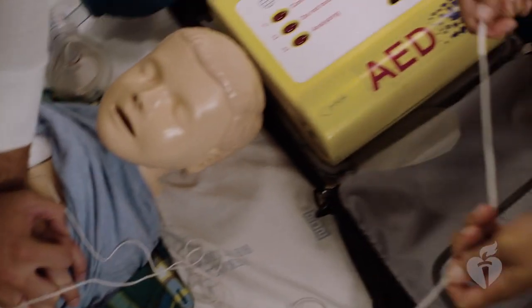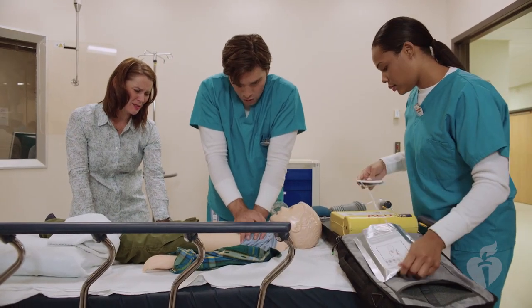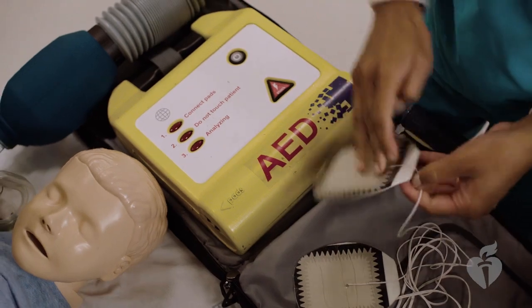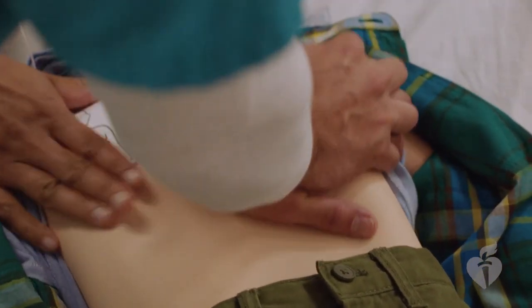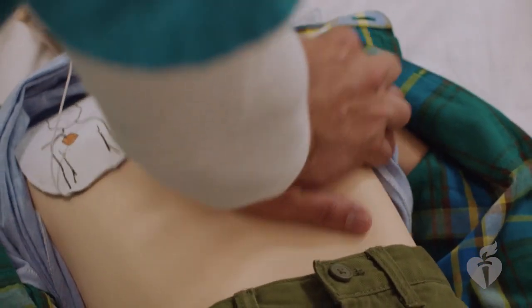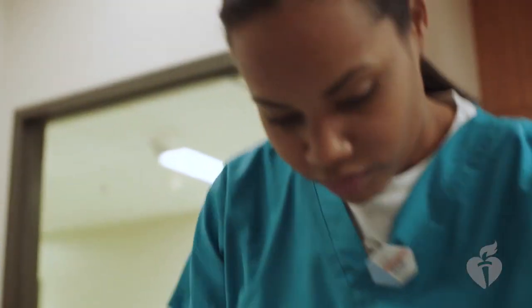You may also need to plug in the pads for certain models. Following the pictures found on the pads, attach the adhesive pads to the child's bare chest. Place one pad on the child's upper right chest, directly below the collarbone, and the other to the left side of the left nipple. After the AED is turned on, some units will tell you to press a button for the device to analyze the heart rhythm. Others will analyze the rhythm automatically.